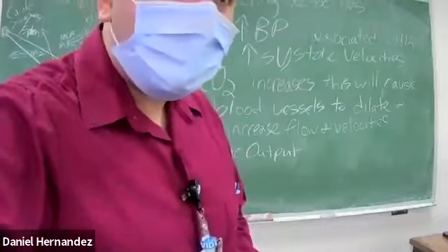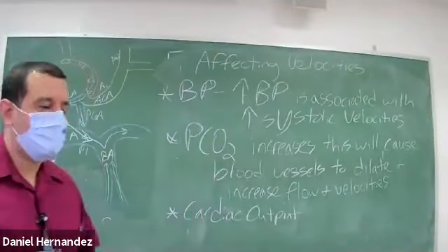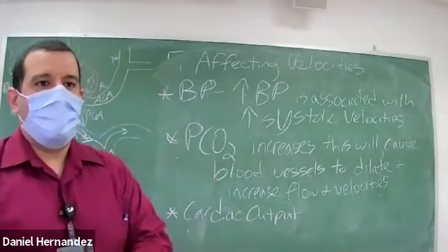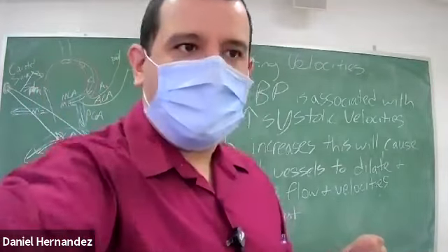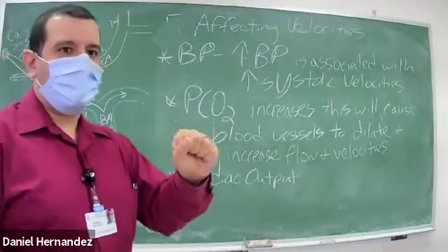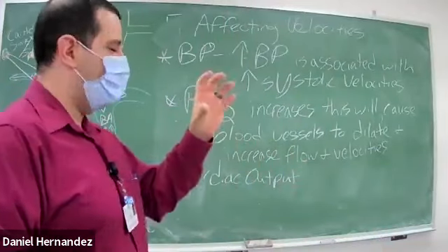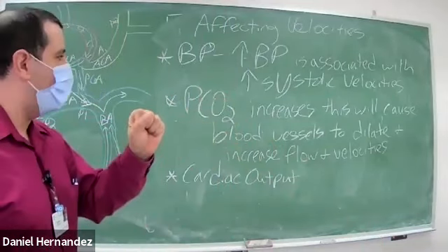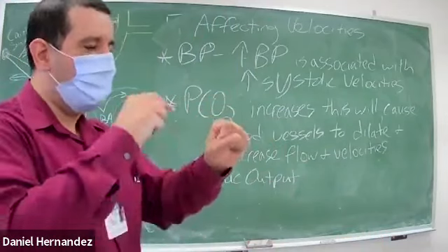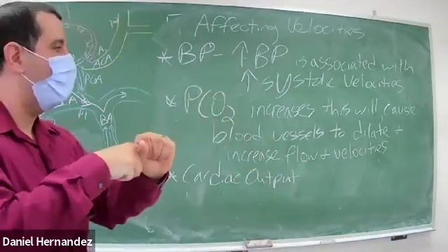Good, no, that's a good question. When they're talking about vessel diameter, the vessels within the brain, if they become more narrow, it's viewed as a stenosis or a narrowing of that vessel, so the velocity is going to have to increase to get through that narrower vessel.